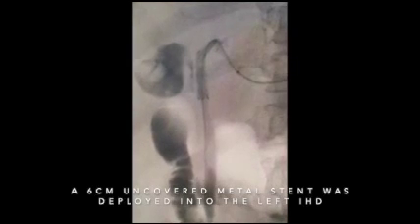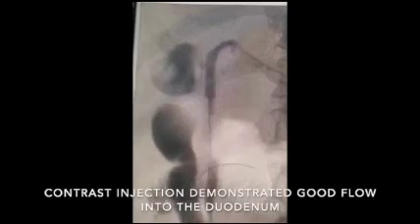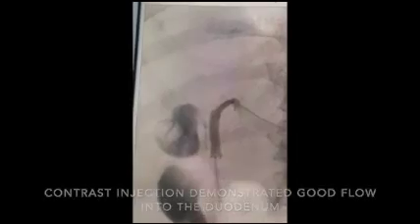Subsequently, a 6 cm uncovered metal stent was deployed into the left intrahepatic duct. After deployment of this metal stent, contrast was injected and demonstrated good flow into the duodenum.